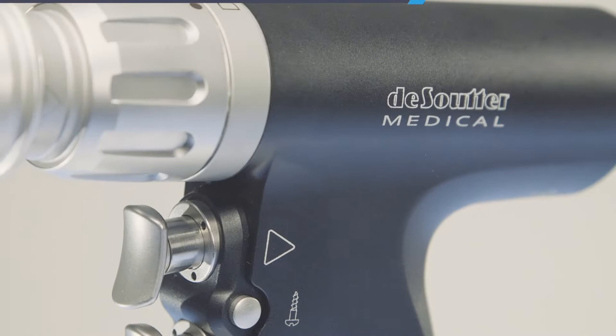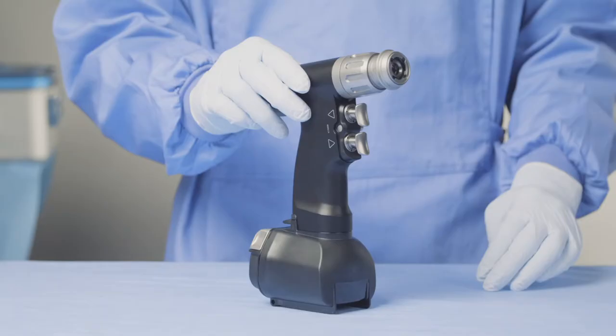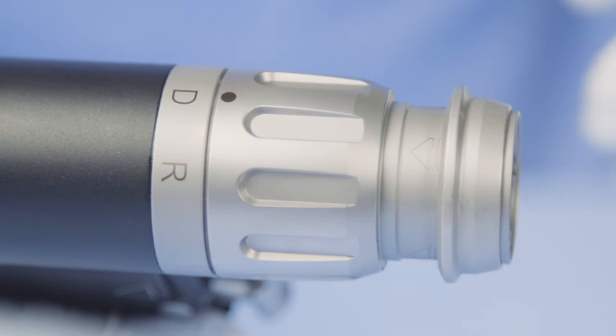The MBQ handpiece contains a drill ream gearbox. This allows you to easily change between drill and ream mode. This can be done by twisting the collar on top of the tool between the D for drill and the R for ream.